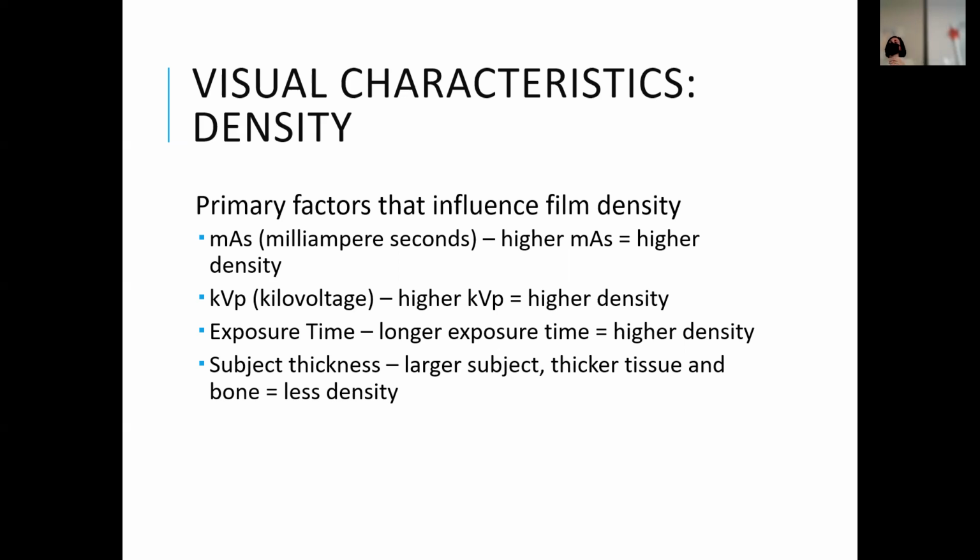Subject thickness: larger subjects, thicker tissue, denser bone, less dense image. And why is that? Why would it be lighter? Yeah, because there's thicker bone, more bone, and it just gets more absorbed.